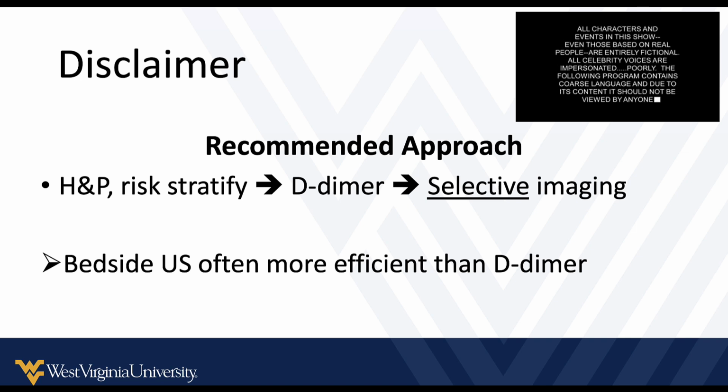However, in most clinical practices, if you have access to bedside point-of-care ultrasound, you can complete that before you would ever get a D-dimer result back. So in clinical practice, it may be more efficient to just do the ultrasound instead of waiting for a D-dimer.